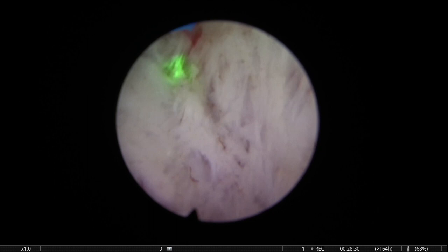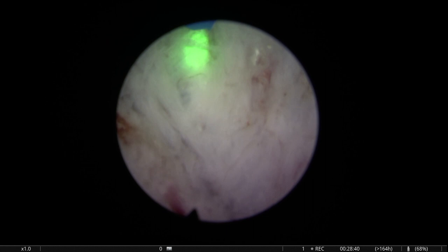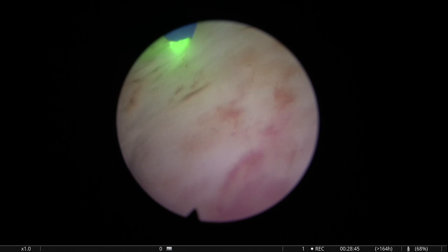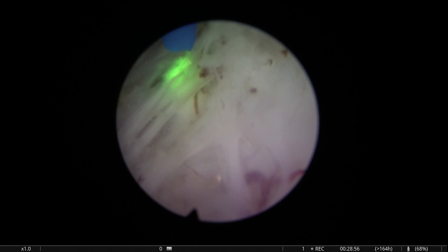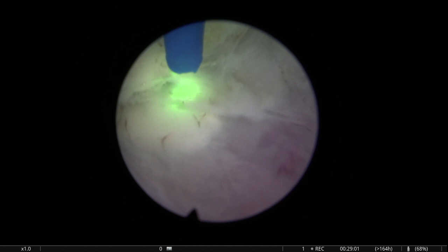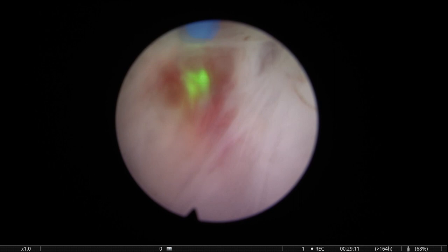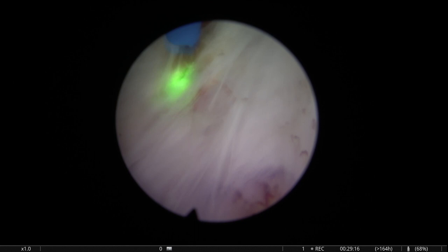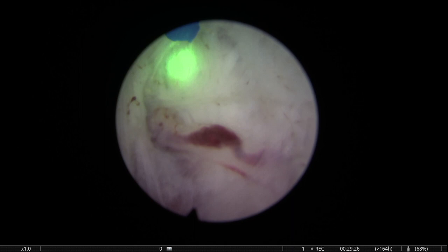And sometimes you also have to keep in mind the spherical-like shape of the adenoma, because you have to take into account where you are accessing the plane from. Sometimes you are under the adenoma dissecting the posterior plane. Sometimes you're lateral. Sometimes you are doing the lateral plane from below. Sometimes you're doing the lateral plane from above. And that can change a little bit the relationship of the direction of the fibers you are cutting and the direction of the plane. All right, so you have to take all these things into account to understand what's going on.